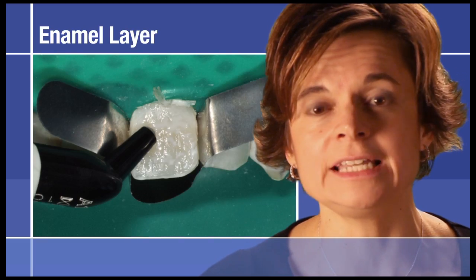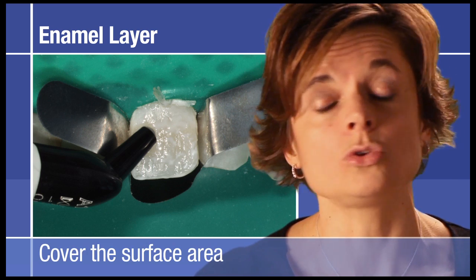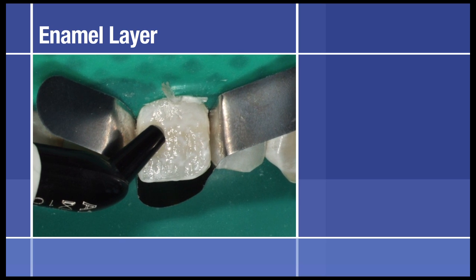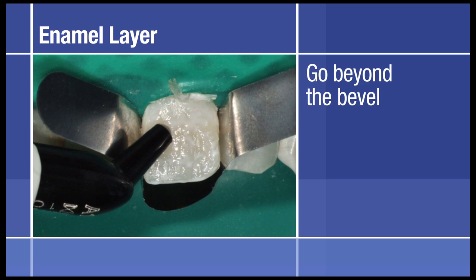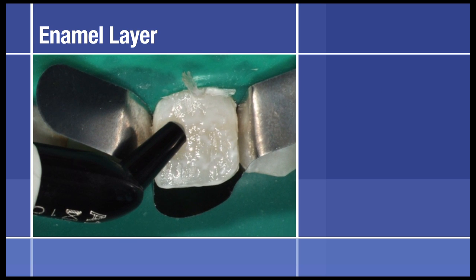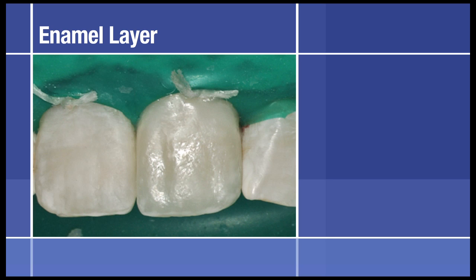We are ready for the final surface layer, the enamel layer. A1 enamel is our basic shade, and we are going basically to cover the whole surface of the tooth here, finishing the A1 enamel cervically to nothing, beyond our bevel there. That layer typically may take a little bit more time because this is when we want to create our final contour, our developmental lobes, and really our nice embrasures, nice surface, because we don't want to have to do much finishing.